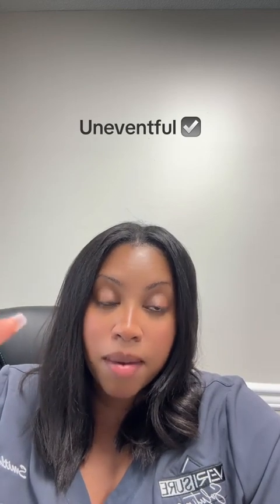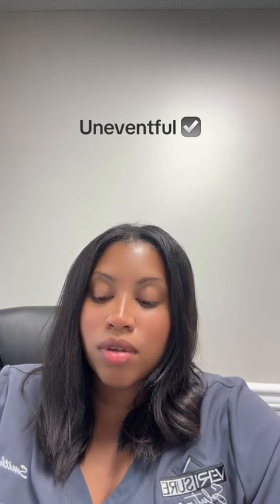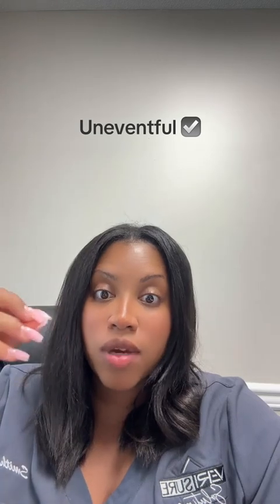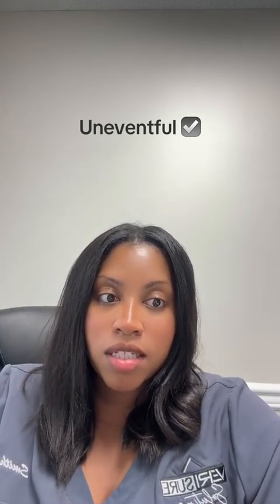So when y'all go do y'all's DOT certifications, it should come with a mock. But if it didn't, because some of y'all are just doing the DOT certification online and need to do your mocks but don't know how to do it, this is how uneventful goes, which again is when everything goes smooth. There's no problems during the collection process.